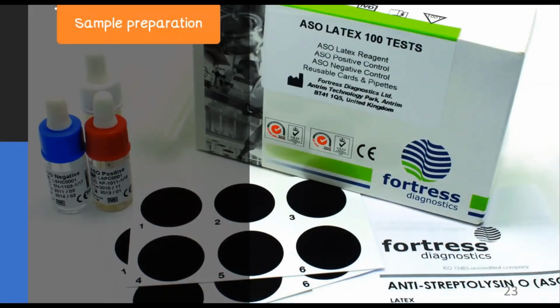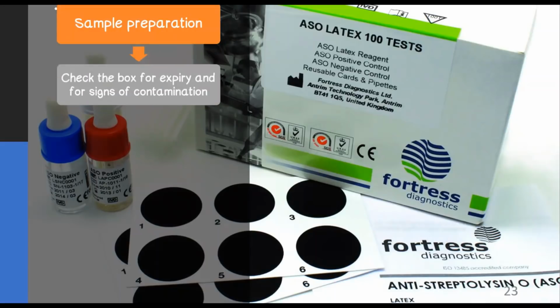First, start with sample preparation. Again, the recommended sample to use is a serum sample. So, separate the serum sample. After which, you get your reagent. Class, before any testing, always check the box for expiry date and for any signs of contamination.